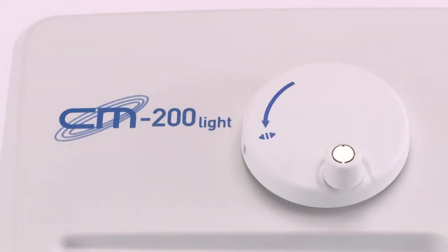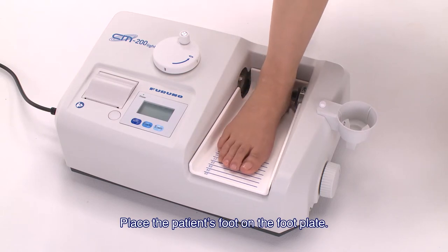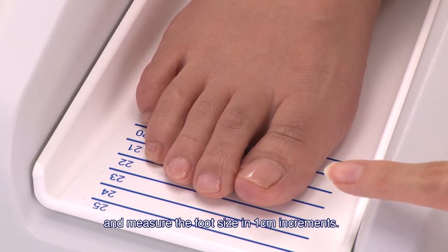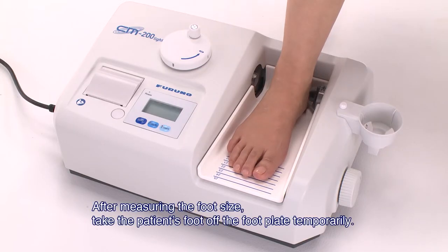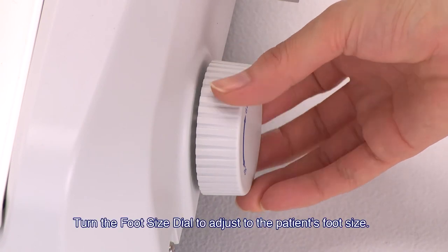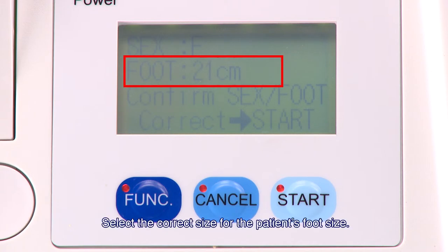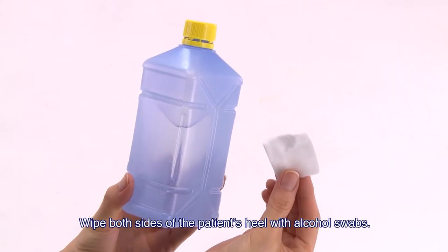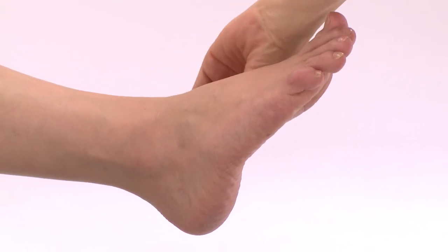We will now proceed to preparation for the actual measurement. Place the patient's foot on the foot plate. Set the patient's heel to the rear of the foot plate and measure the foot size in 1 cm increments. After measuring the foot size, take the patient's foot off the foot plate temporarily. Turn the foot size dial to adjust to the patient's foot size. Sizes are displayed in 5 steps on the screen. Select the correct size for the patient's foot size. Wipe both sides of the patient's heel with alcohol swabs.